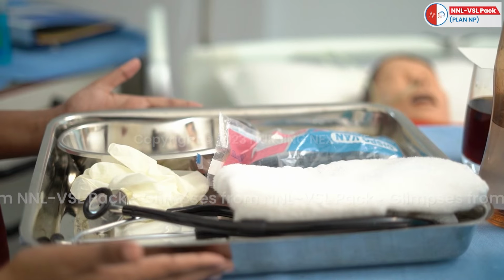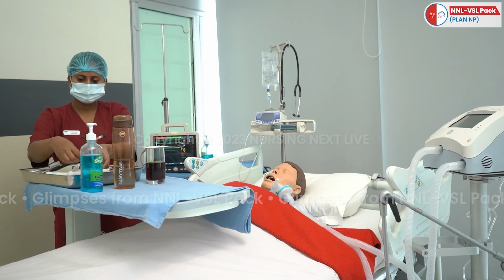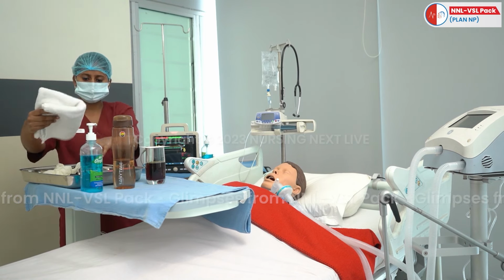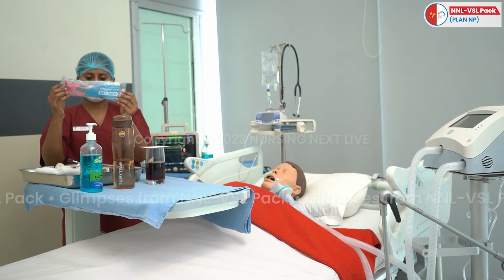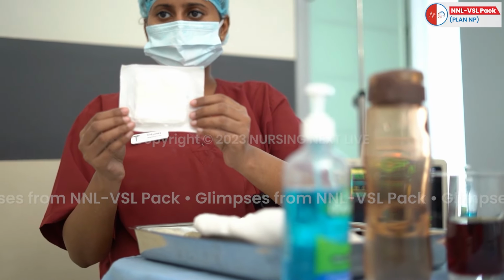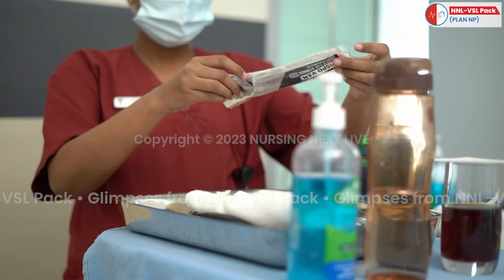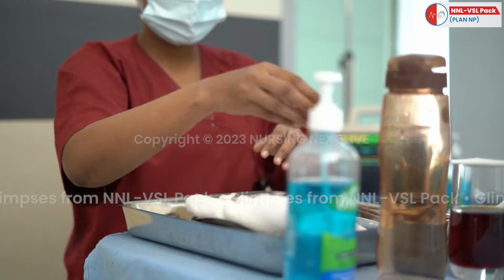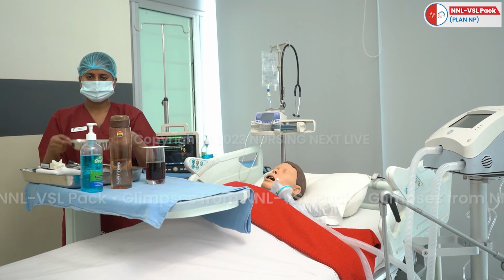A tray containing clean gloves, towel, 50 cc syringe, gauze pieces, 10 cc syringe, plain water, stethoscope, kidney tray.